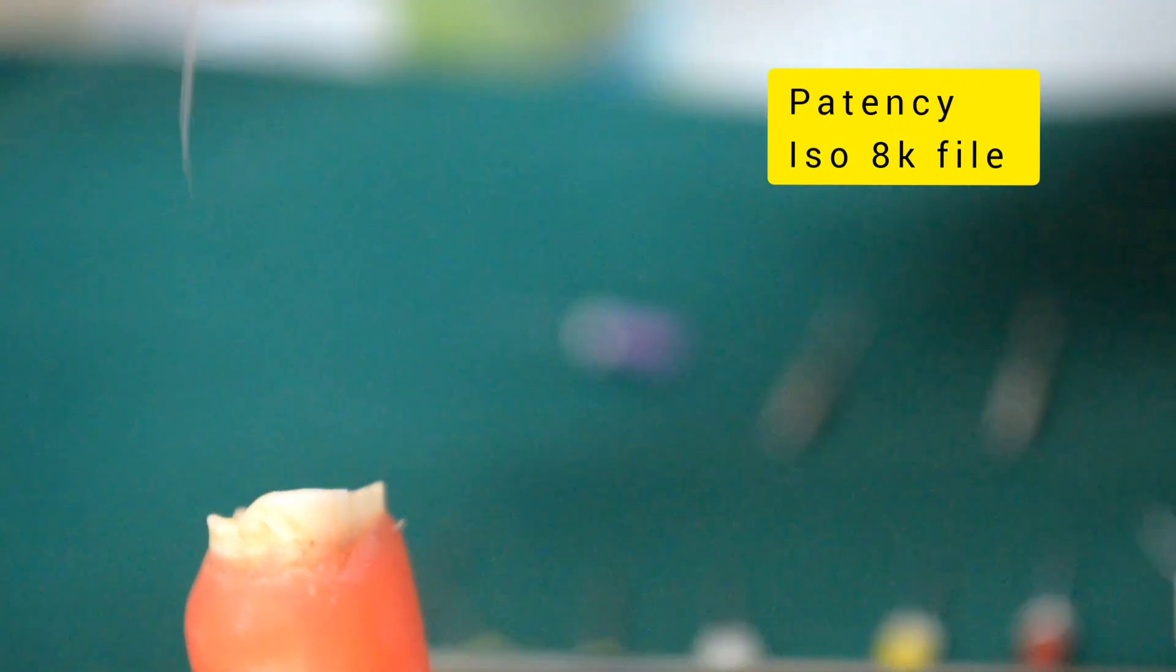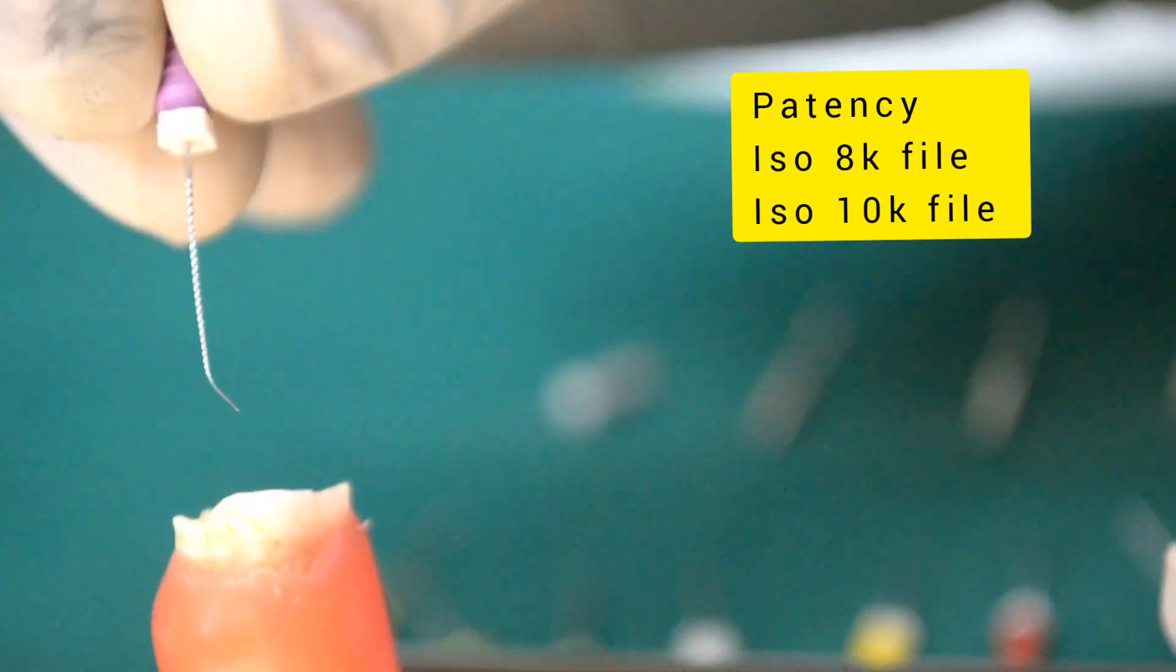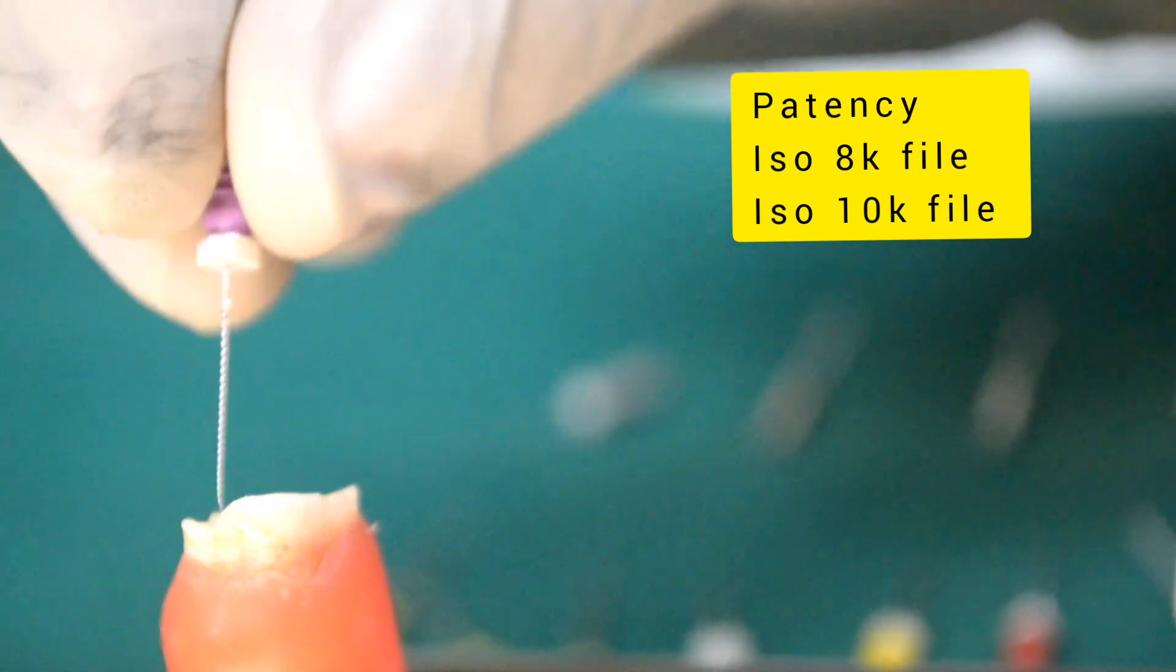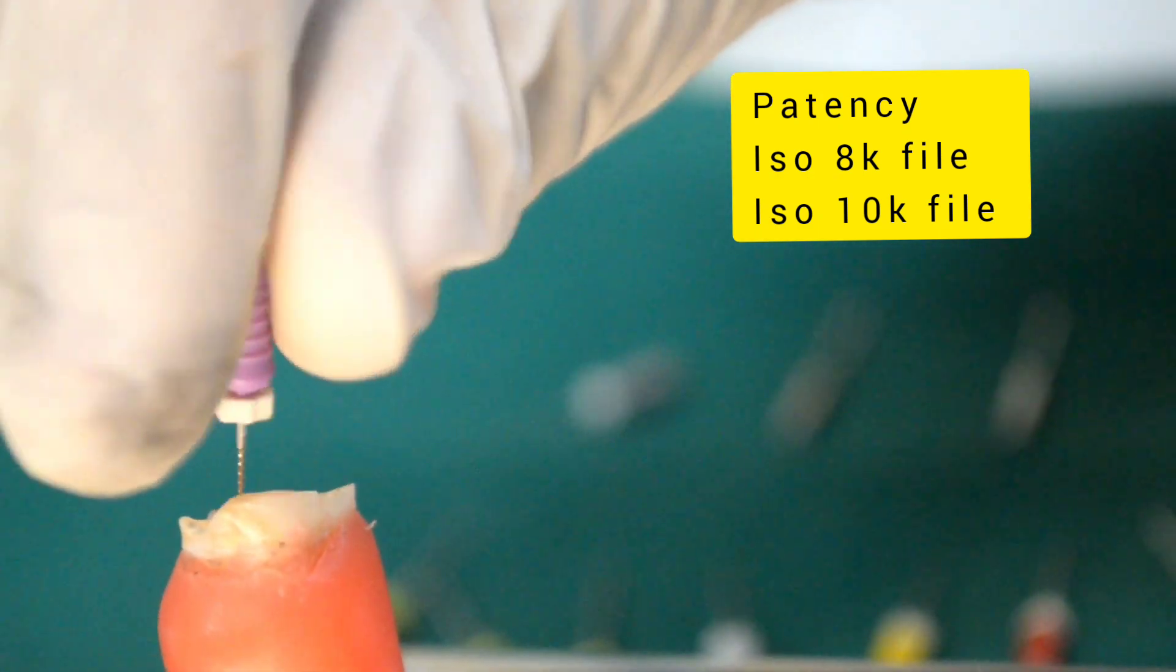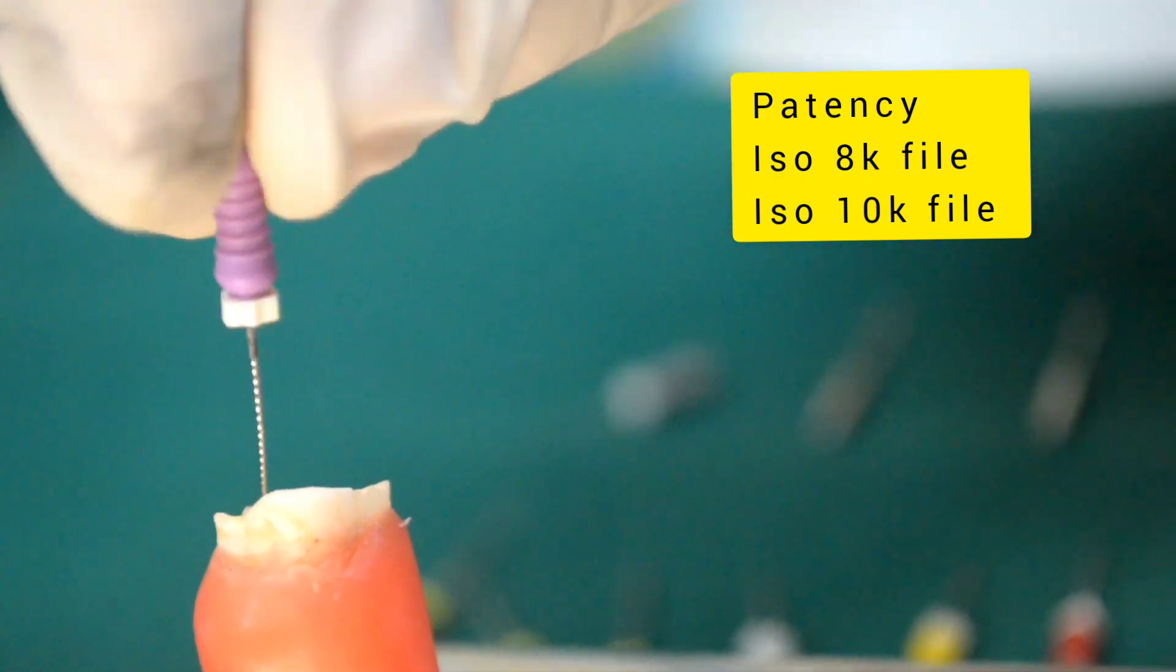This is followed by placing the pre-curved 10K file in a watch winding motion. Obtaining patency with number 8 or 10K file forms the first step in any technique of root canal shaping.